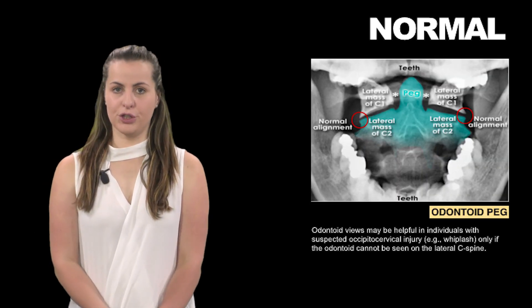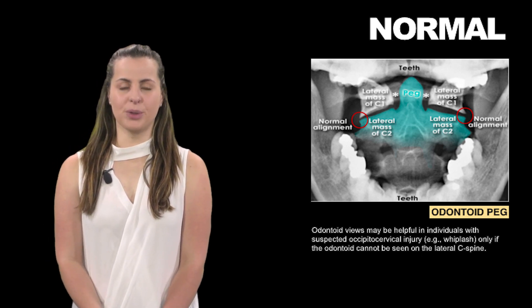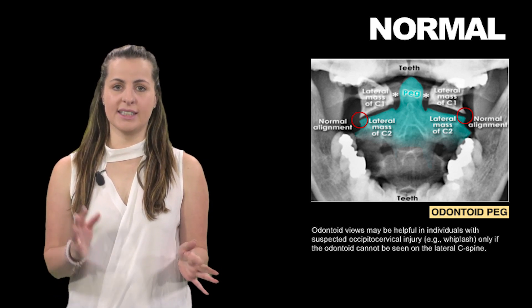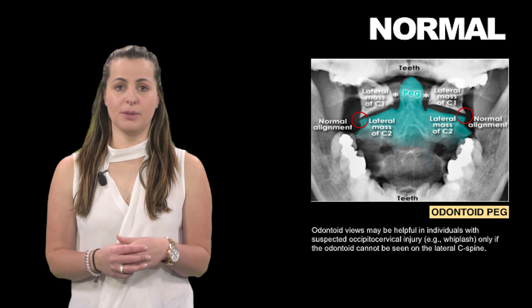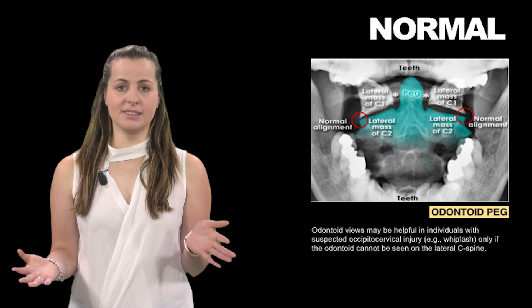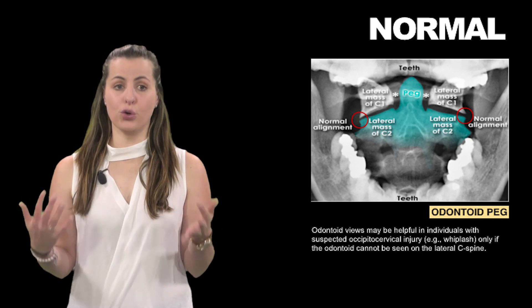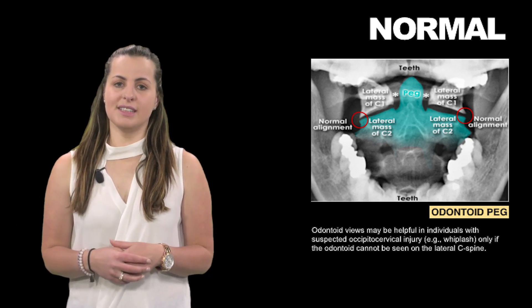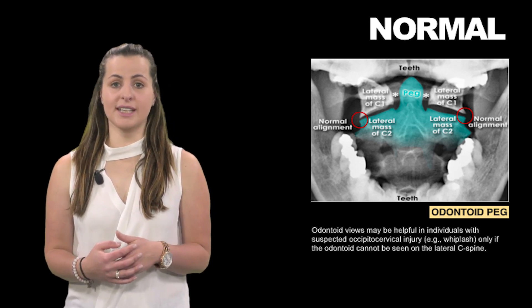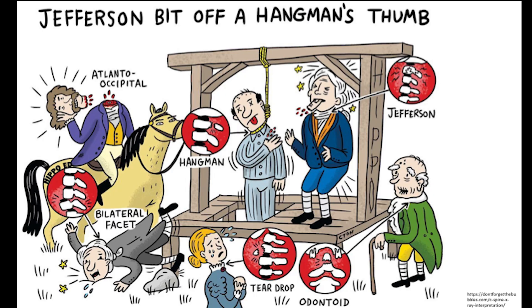The odontoid peg or open mouth view is considered adequate if it shows the alignment of the lateral processes of C1 and C2. The distance between the peg and the lateral masses of C1 should be equal on each side in a normal individual. Note that in this image the odontoid peg is fully visible, which is not often achievable in the context of trauma due to difficulty in patient positioning.